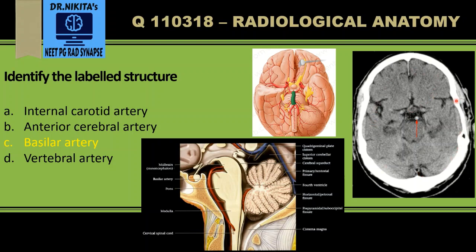Corresponding to it on the CT image, here would be the terminal internal carotid, which divides into the middle cerebral artery running along this course, and the anterior cerebral artery located anteriorly in the interhemispheric fissure.